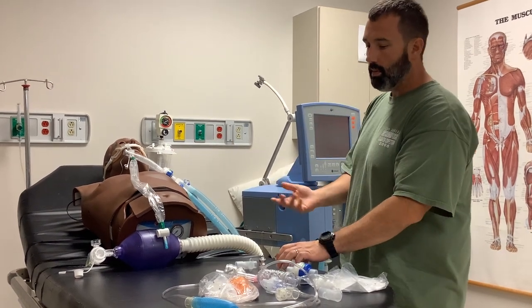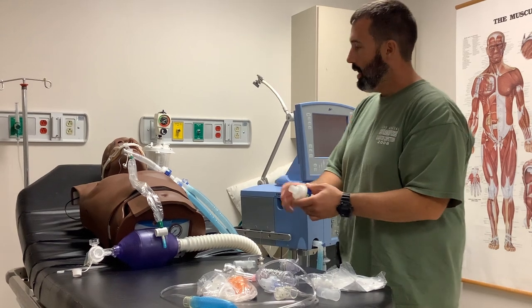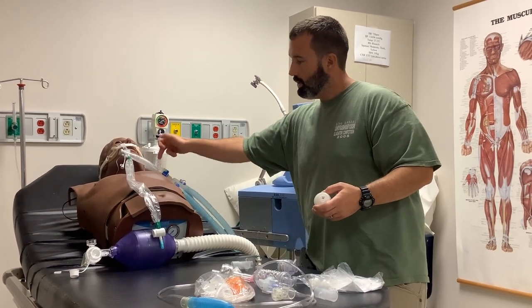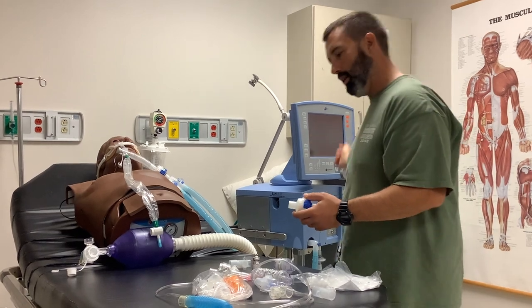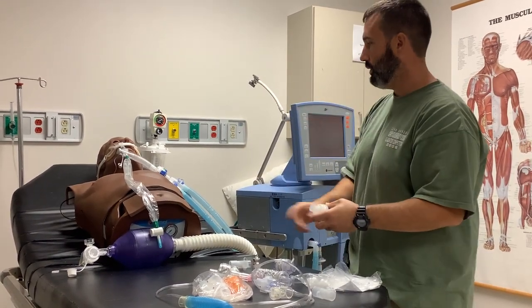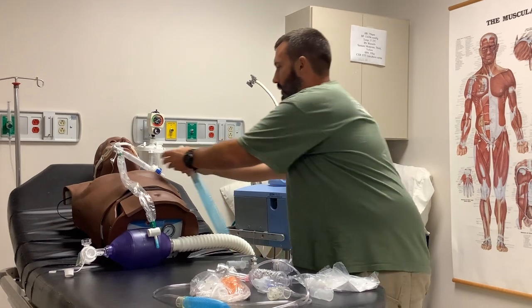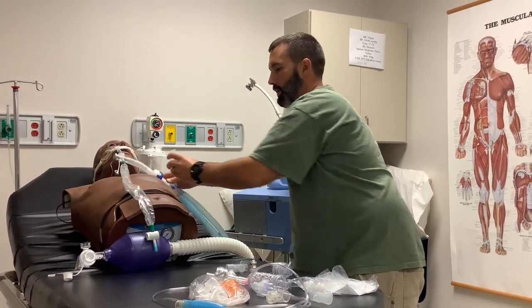HMEs have to be changed about every 48 hours depending on your hospital policy. If I'm going to go in and change out this HME, I'm not breaking the circuit at the patient end - I'm going to break back here. Because any fluid sitting there, if you don't put the ventilator in standby, it's going to fire a breath and spray and aerosolize everything. But if you break it here, you can just put that on, take that HME out, and you didn't get sprayed with anything.